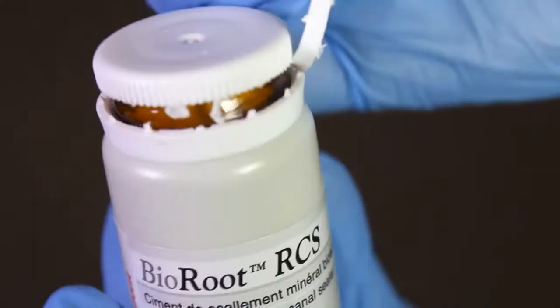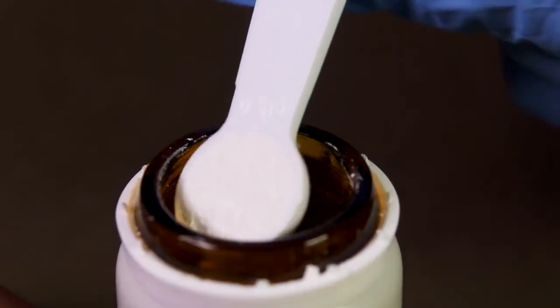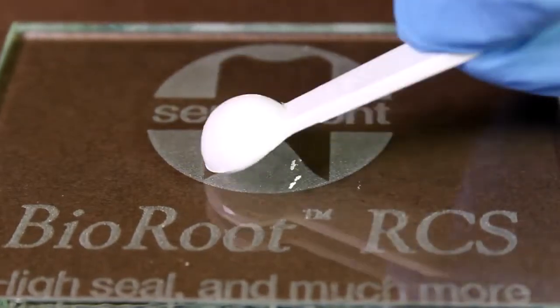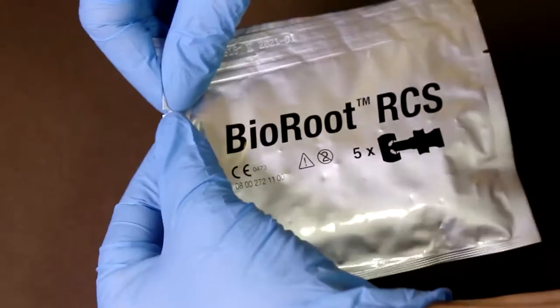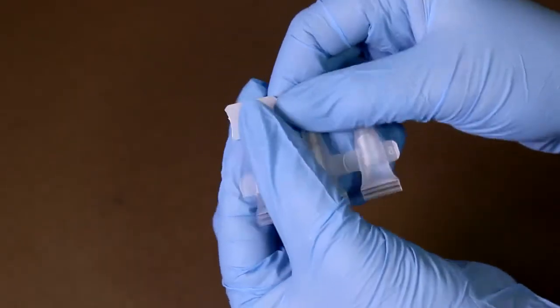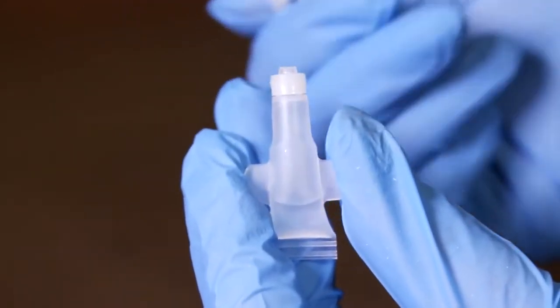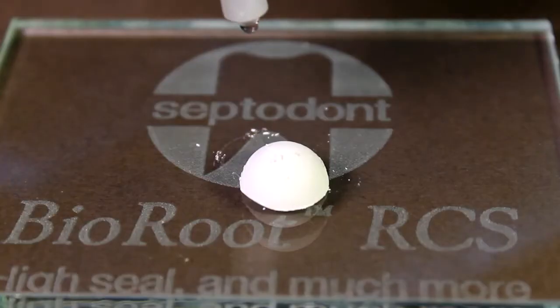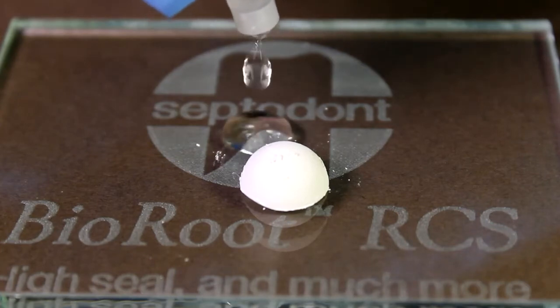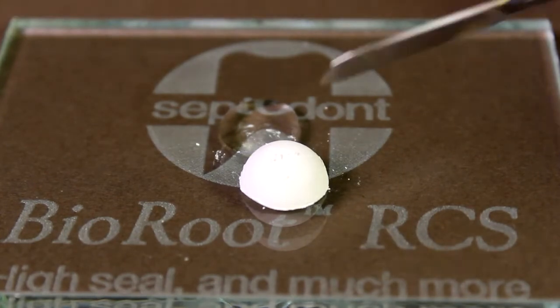Open the bottle of powder and, using the spoon supplied in the box, place one level measure of Bioroot powder onto your mixing pad. Open the pipette package and snap off one pipette. Twist and pull the pin out of the top of the pipette, then, holding vertically, squeeze the pipette and maintain pressure until five drops have been dispensed onto the mixing pad.